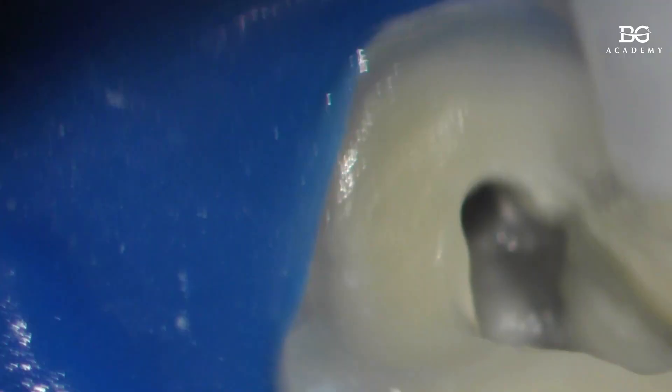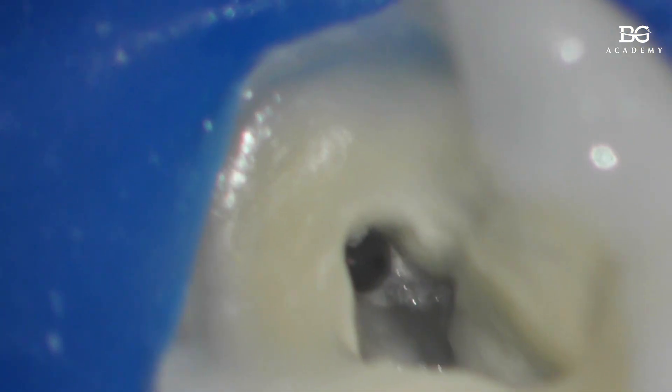Now just look at how everything looks right here. These canals can merge together.